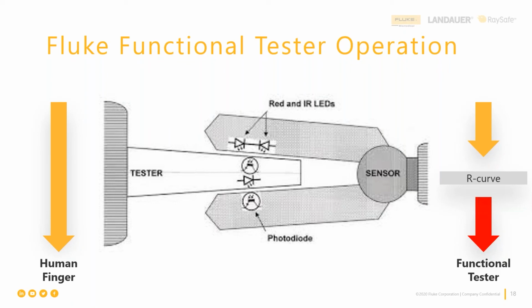Yeah, it's truly amazing how much thinking the functional tester needs to do in the background to be able to simulate that human finger as closely as possible. Right. Okay, we can go on to the next slide, Mike.